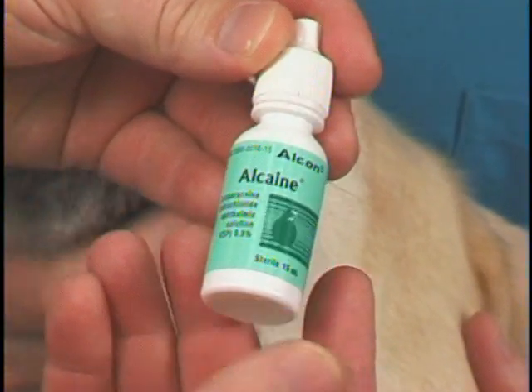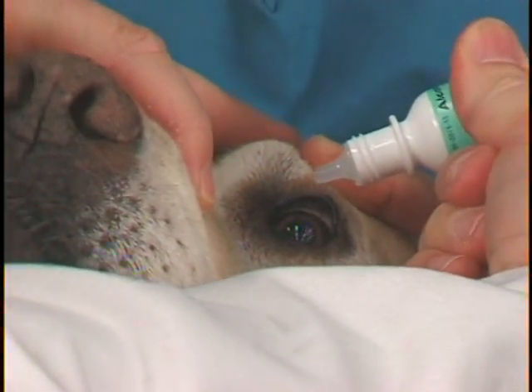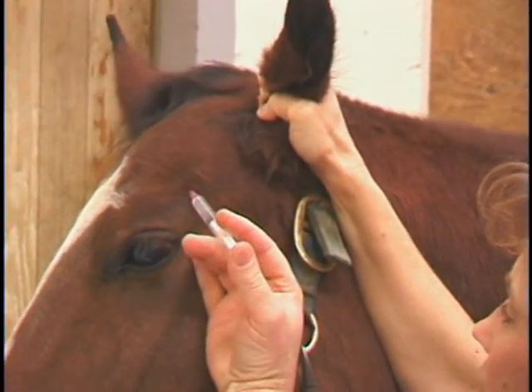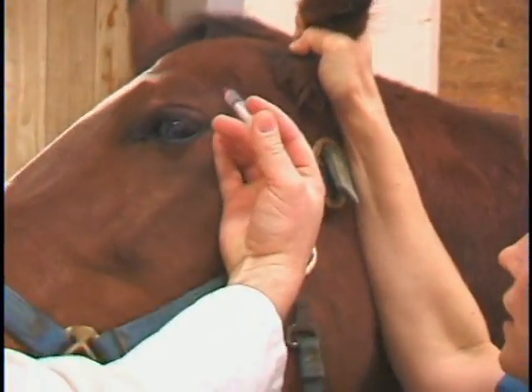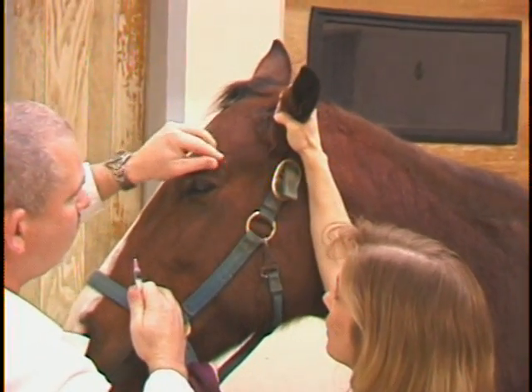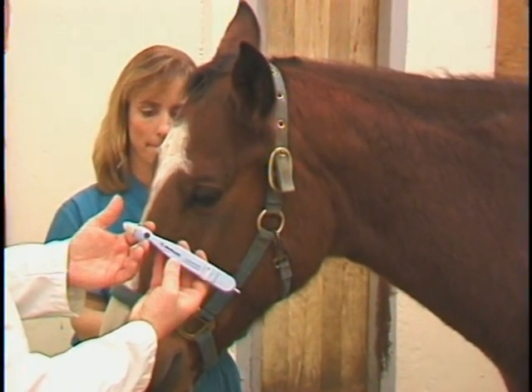For small animal patients, apply a drop of 0.5% proparacaine to provide topical anesthesia. In horses, topical anesthesia and auriculopalpebral nerve block are used to achieve an accurate reading. The animal is minimally restrained. The eyelids are gently opened without putting tension on the eyelids or the globe. Aggressive restraint or excessive eyelid tension will artificially elevate the intraocular pressure and give erroneously high readings. This is especially true in the horse.